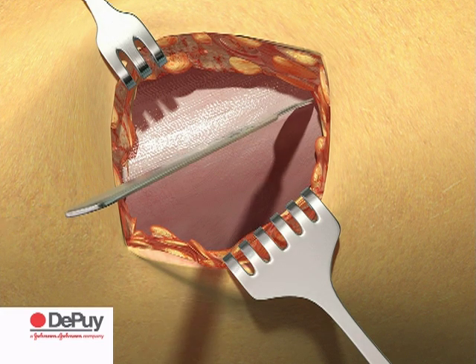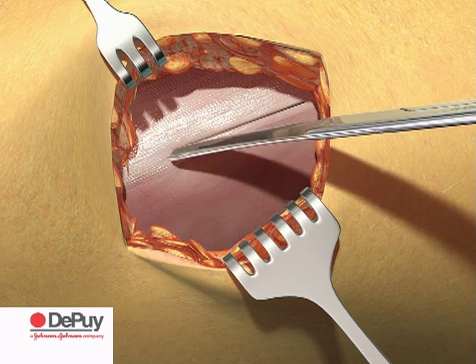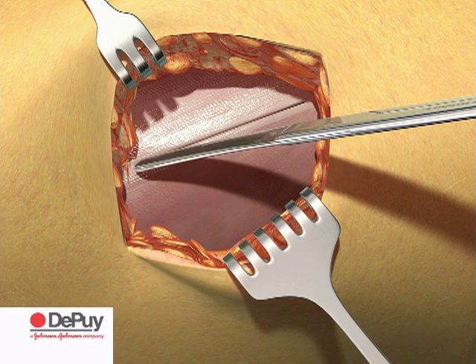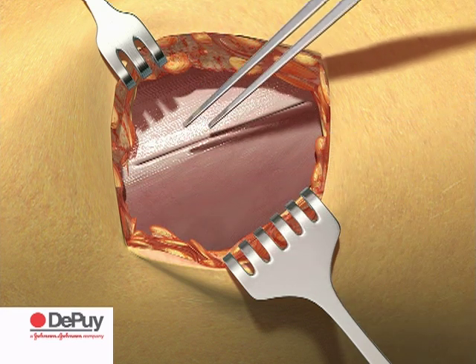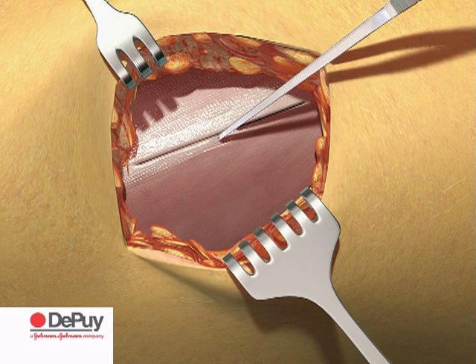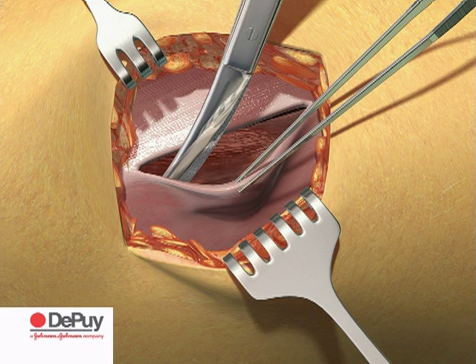Incise the fascia approximately 2 to 5 mm medial to the underlying border of fascia latae, following the direction of the skin incision. Use scissors and blunt dissection to separate the tensor fascia latae ventrally from the fascia, following the plane of incision down to the capsule of the femoral neck.